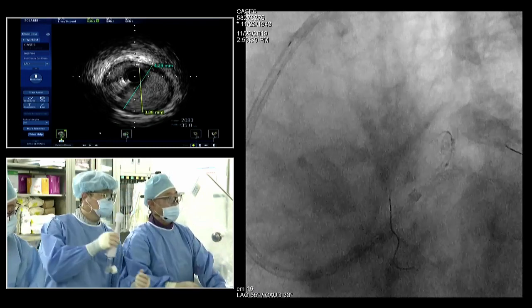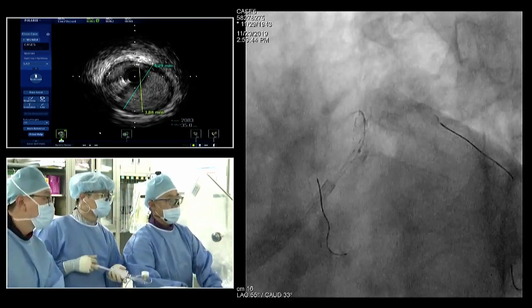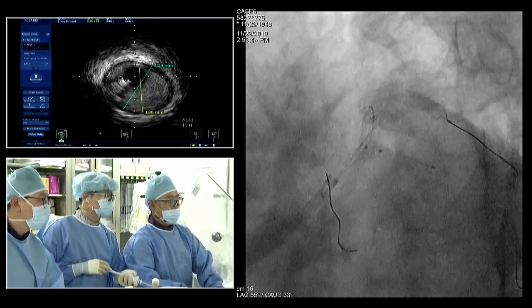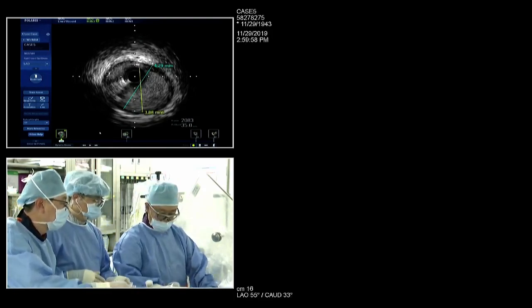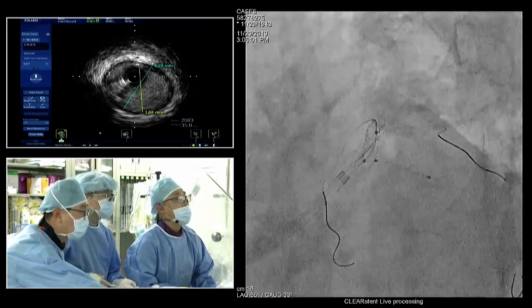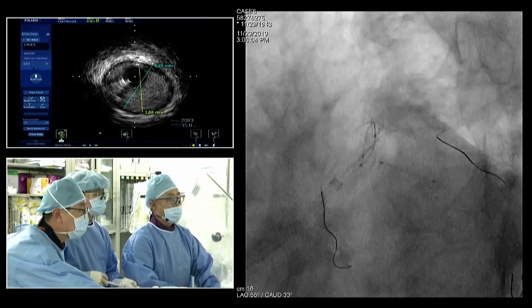Is that much? It's 3.0. Okay, cool. The region. Now here is the main. I'll do the boost from behind and come out. New one. In the case of a non-compliant balloon, a reused balloon is always difficult to pass.